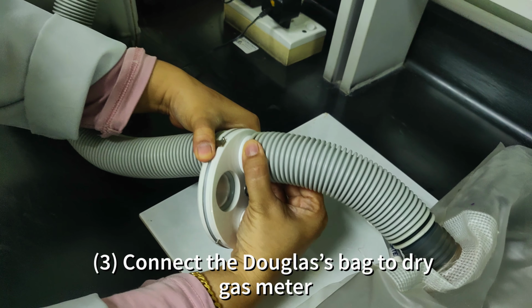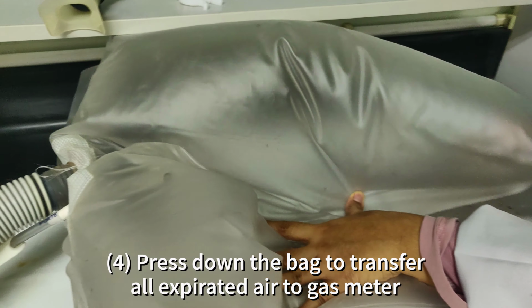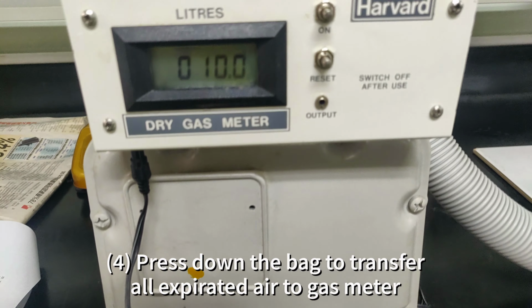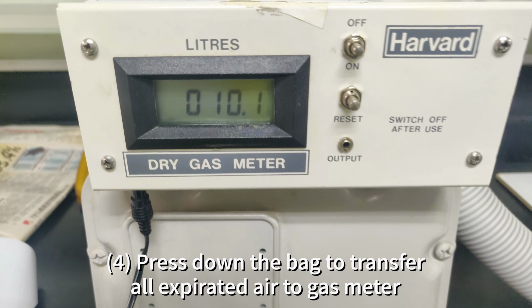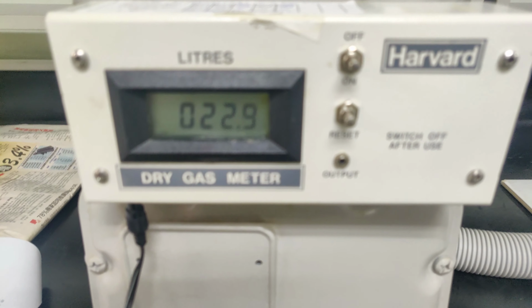We need to change the side for the tube, and then we need to press the bag to transfer all the air to the dry gas meter. You can see that the volume on the gas meter has already increased and keeps increasing.